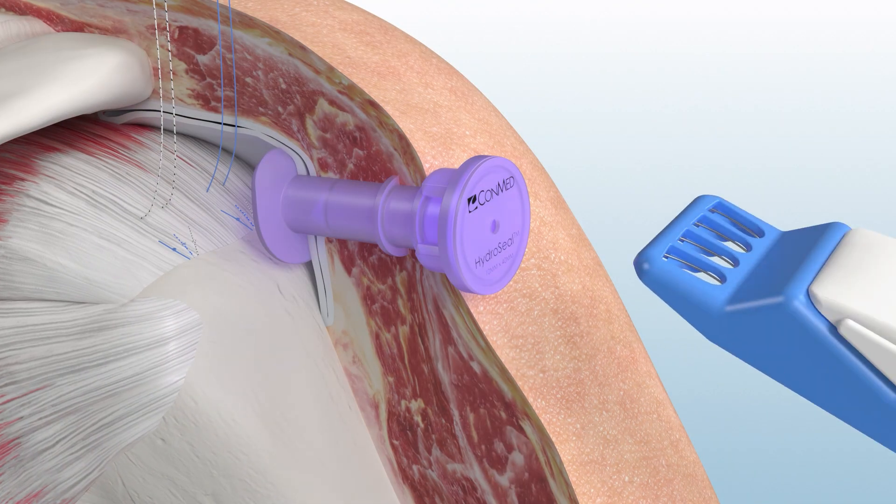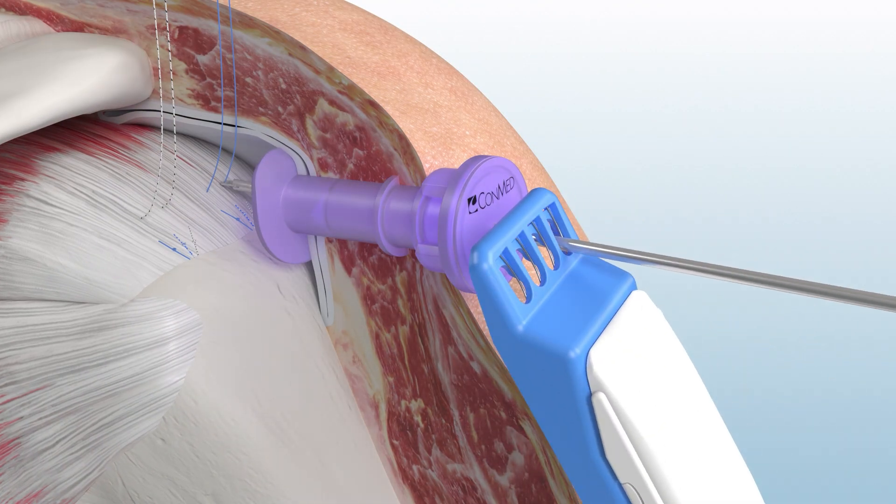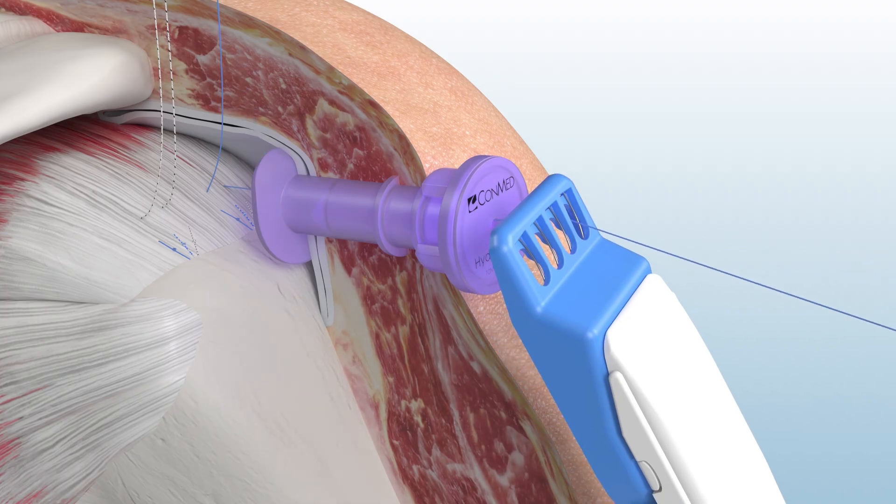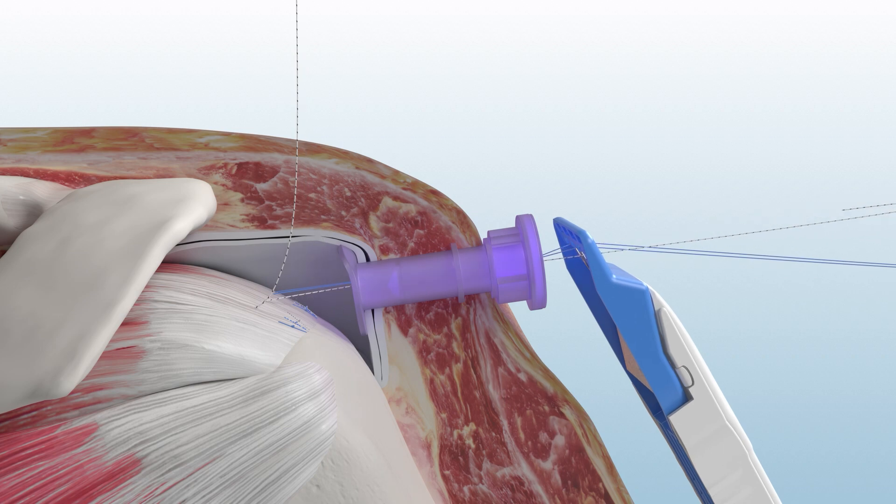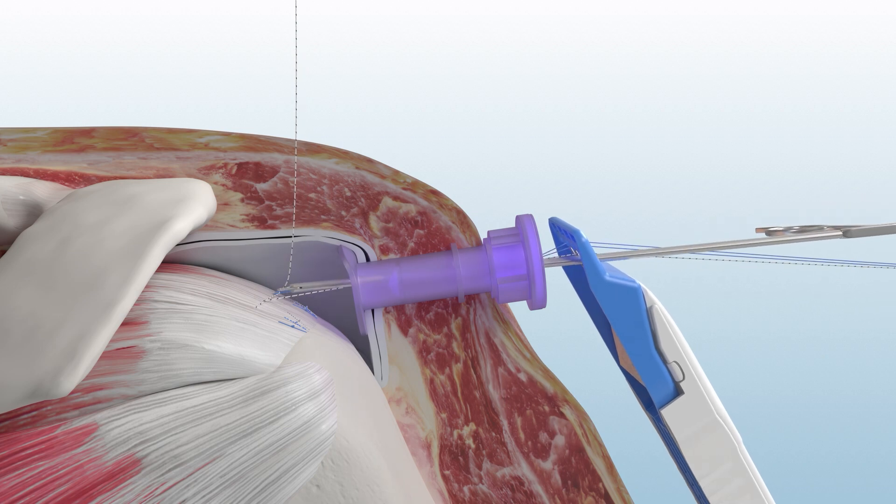Now, align the integrated suture organizer of the Biobrace RC delivery system with the lateral cannula. Using a ring grasper, load each suture, one by one, through its dedicated hole in the suture organizer.